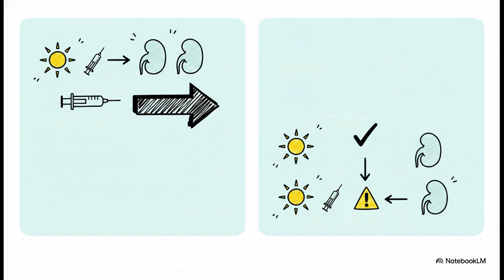Here, you start directly with the post-Captopril scan on day 1. And if that Captopril scan is completely normal, congratulations, the test is over. The patient doesn't even need a baseline scan. They only come back for day 2 if that initial scan shows abnormalities that we actually need to compare.